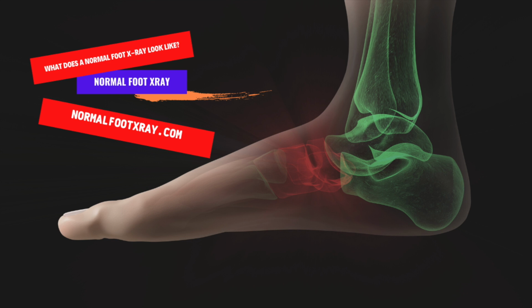X-rays are essential for various medical purposes, including diagnosing broken bones and dislocated joints. They can also help physicians determine if a particular surgery will be effective. They can also help plan the procedure if you have a foot ailment and are concerned about the results. They can also diagnose certain types of cancers. These tests are often ordered because of trauma and various illnesses affecting the foot.